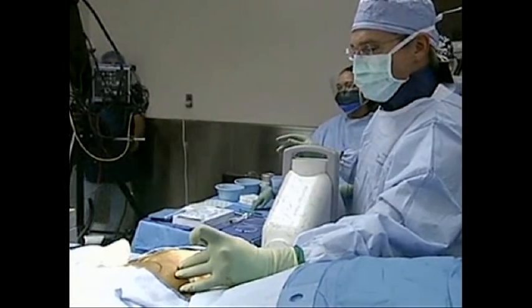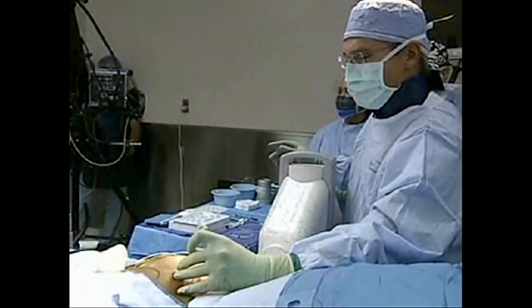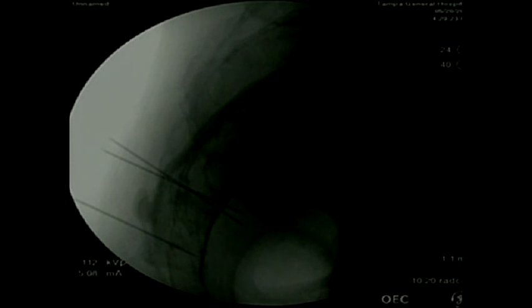Dr. Rodriguez is trying to place the needle. On the fluoroscopy, you can actually see him passing the needle just below the other two needles, entering the foramen. He'll try to get it just below the surface of the bone so he can stimulate just that nerve as it runs right in that area, right below the foramen. This is a very safe procedure — there are no major structures that can be damaged as he passes the needle. He'll try to get into that inner corner to get the best results of stimulation.